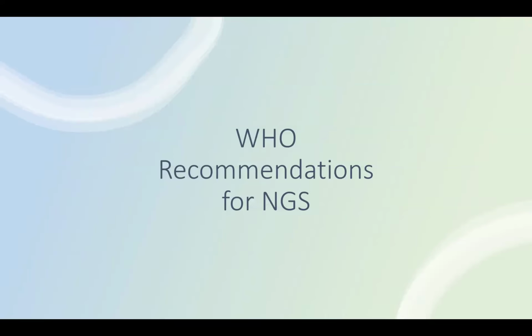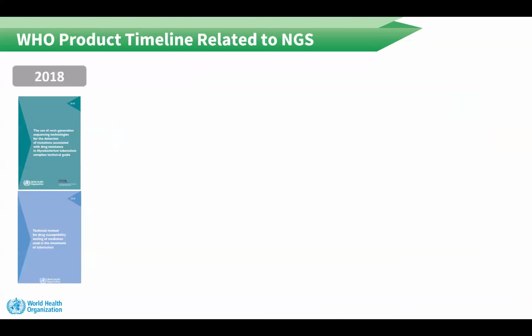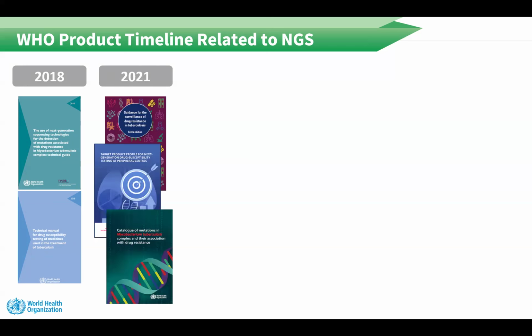So let's quickly look at the history of WHO recommendations for next-generation sequencing. These first started in 2018 with the release of a technical guide on the use of next-generation sequencing technologies for the detection of mutations associated with drug resistance in Mycobacterium tuberculosis complex, alongside a technical manual for drug susceptibility testing that updated critical concentrations for use of phenotypic DST to which TNGS results can be compared.